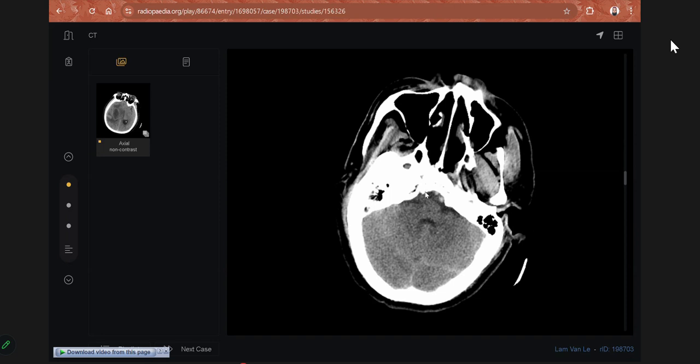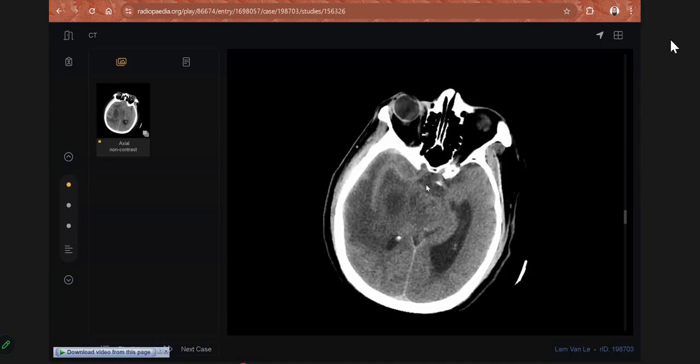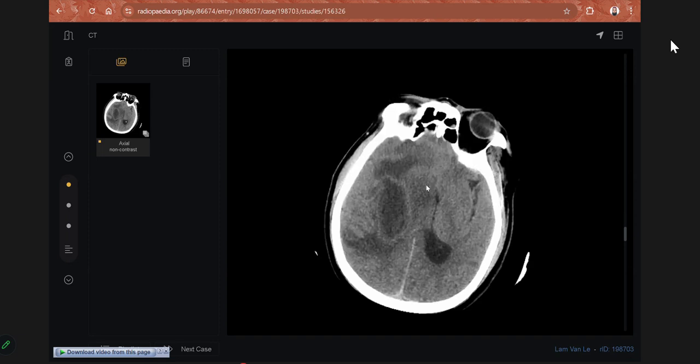So if this one is an abscess, how is the appearance of the ring enhancement? Then also the clinical history will help, because I will look for any elevated inflammatory markers in this patient, and whether a fever history or any previous infection history is there regarding any other etiology. Yeah, this patient presents with weakness and a fever. So my top differential would then be abscess. If the patient is stable, I will also prefer to go for MRI with contrast.